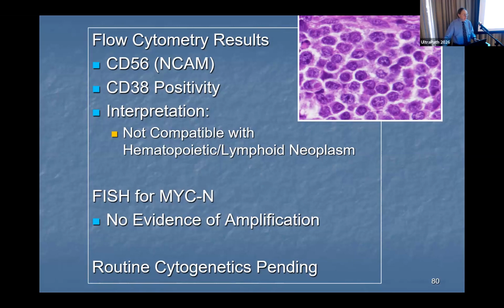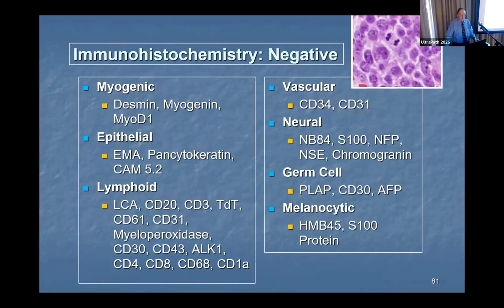I was actually at the Children's Oncology meeting when this case happened, so I really didn't get a chance to see it until I came back. And one of the things I was trained was that you don't do more than 4 immunostains at a time. My colleagues basically went through and just emptied the antibody library that we had because they couldn't figure out exactly what it was.